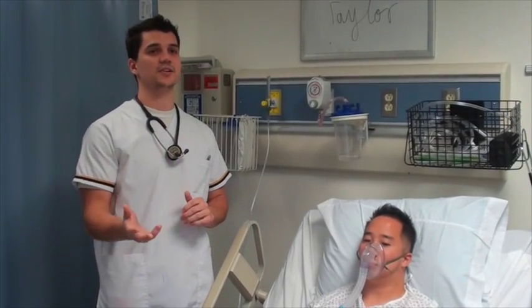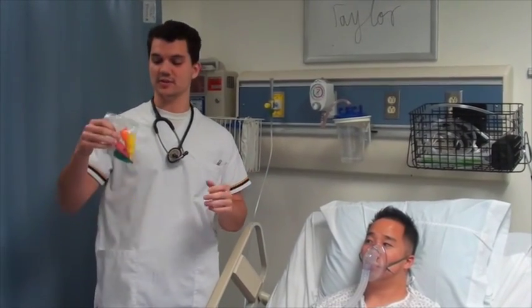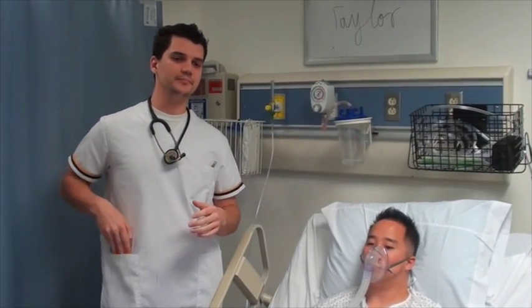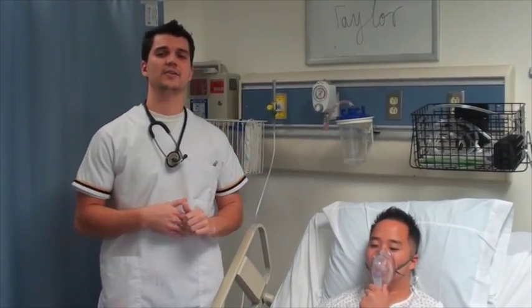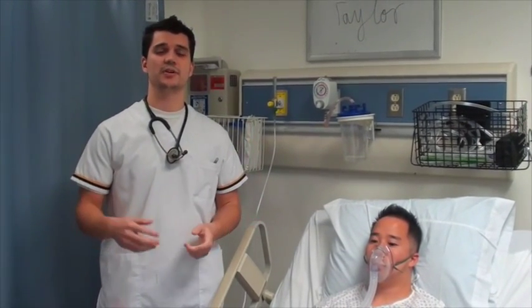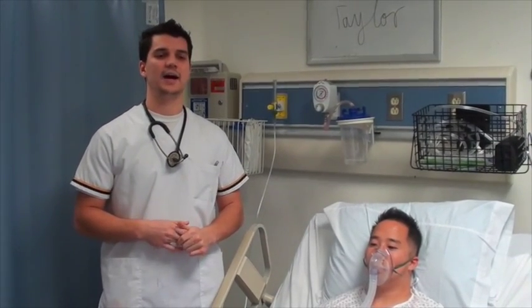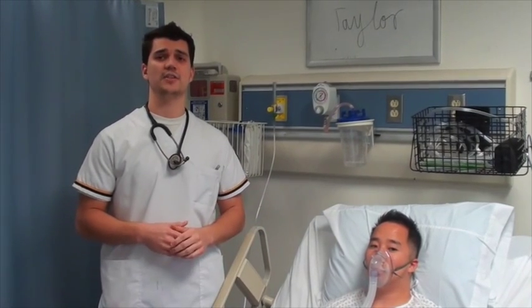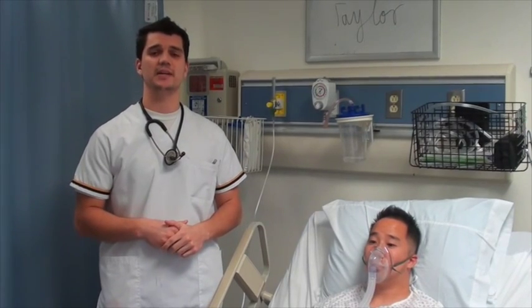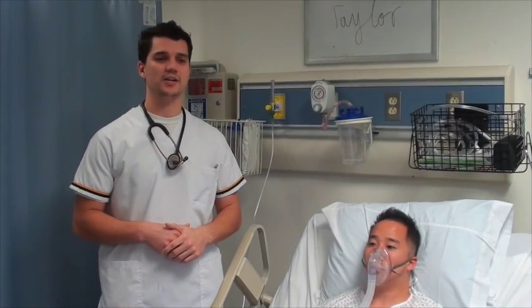So it depends on your entrainment device. If, for instance, you want to start at 24%, you'll use a certain color. And if you want to go all the way up to 50%, use a different color. So it can be either a low rate or a high rate. You also have an adapter that you can put on for increased humidification for the patient's comfort. It's a short-term therapy used in the hospital setting. It's especially helpful for patients with COPD because it gives you a constant low flow rate of oxygen.